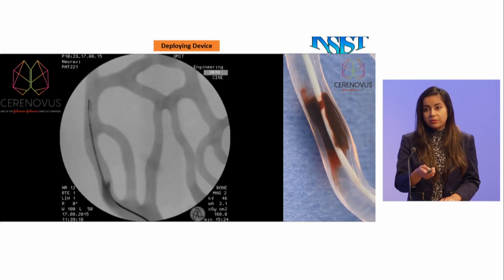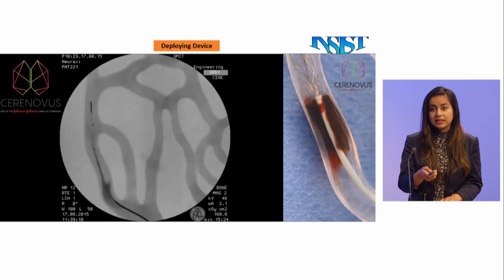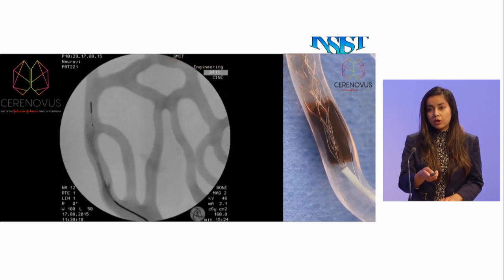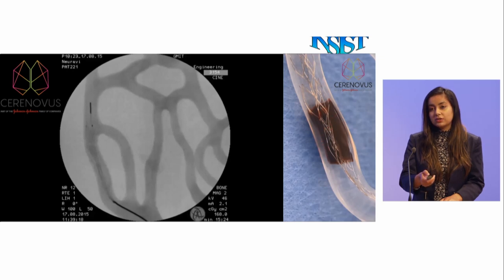Before the thrombectomy procedure it is very important that the device is placed correctly in position. Here you see an actual scan of this model on the left, and on the right you see what actually happens in the vessel. When this embo trap device opens, the struts engage with the clot and that engagement holds the clot in place, so when the device is pulled back the clot also moves.